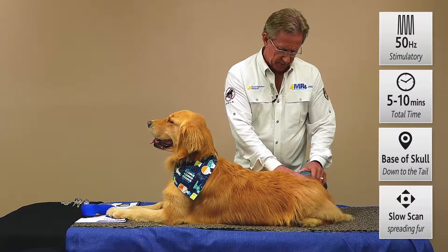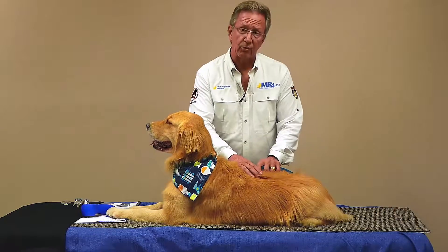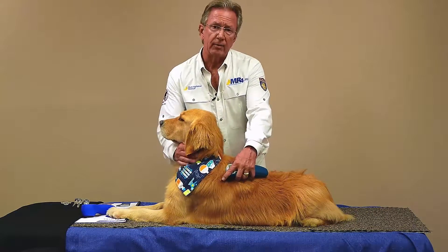So with an older dog, this variation to stimulate along the spine is also terrific. You're hitting those bladder meridians right through here if you're in the acupuncture world, and it just has wonderful beneficial effects. Nice that it has no side effects — no side effects from laser, unlike a lot of drugs. That's the unwind protocol, which is always a great place to start.